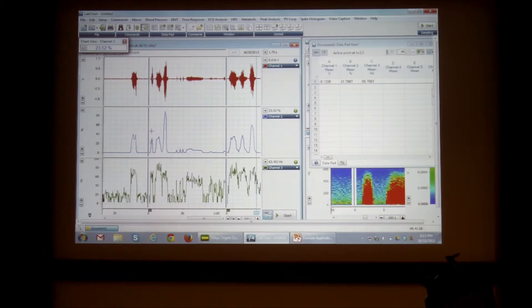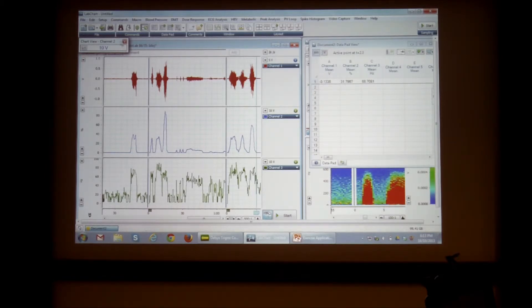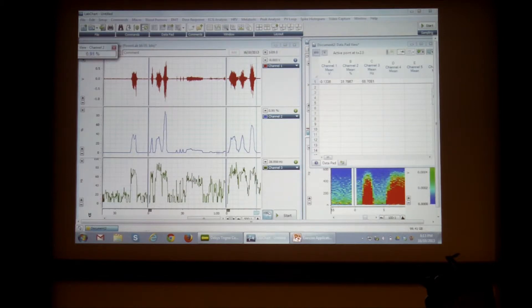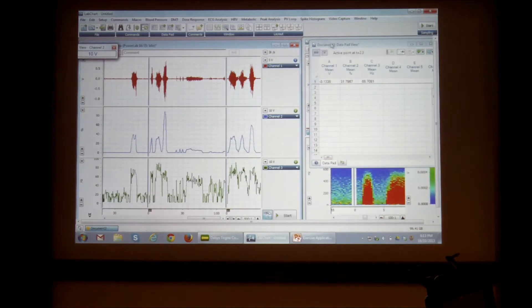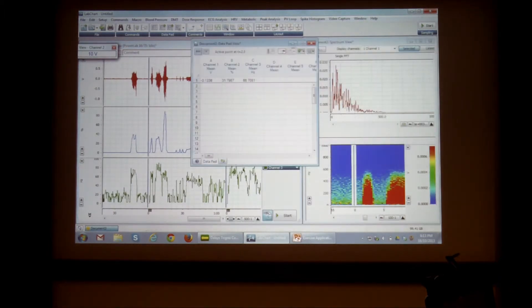So what I'm going to do, I'm going to go into channel 2 and click in there. So I'm going to close my loop again, actually.